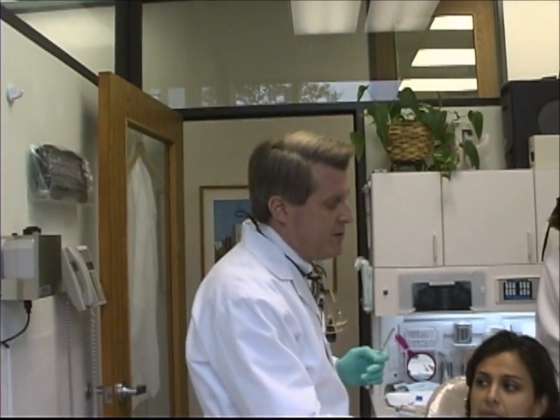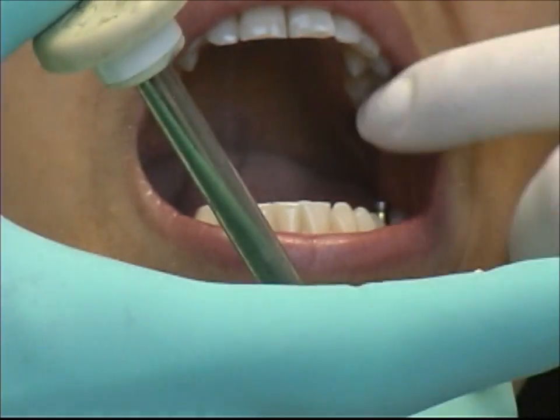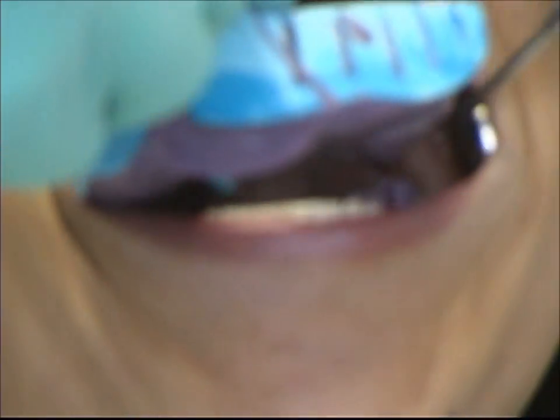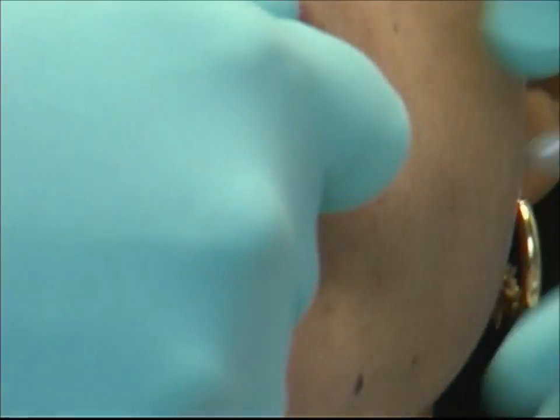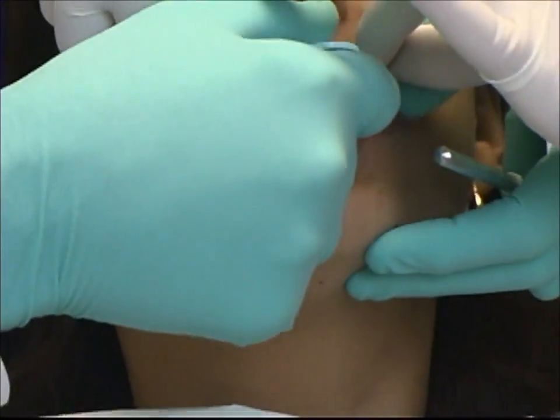Now I'm going to inject around there — open kindly. We're injecting around our implant post, and we'll gently have the patient bite and hold together.